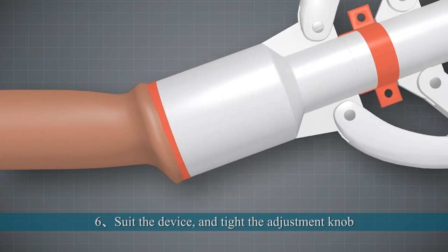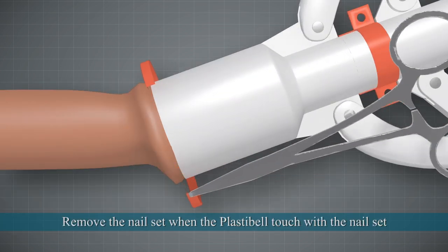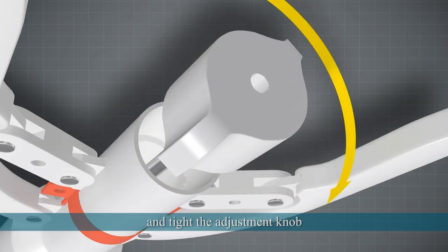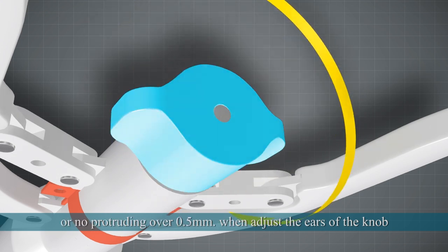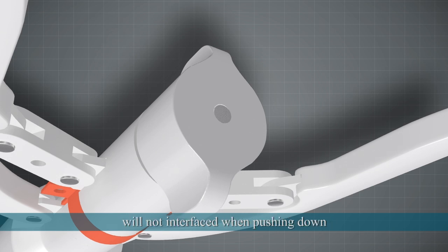6. Fit the device and tighten the adjustment knob. Remove the nail set when the Plastic Bell touches the nail set, then tighten the adjustment knob to keep the end of the bar parallel with the backside of the knob or no more than 0.5mm protruding. When adjusting, avoid the handle to ensure it will not interfere when pushing down.